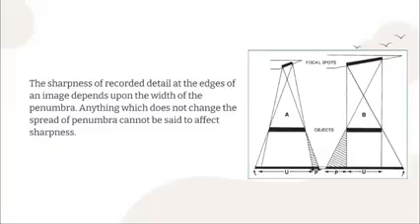The high heat dispersion of the rotating anode makes it possible to use these smaller sizes and maximize image sharpness. Since we now utilize rotating anodes compared to the stationary ones, dili man sila gatuyok. So that means ang area na maigo sa small focal spot is larger than before. Okay, since nagatuyok naman siya, dili lang siya ma-confine sa isa ka area.